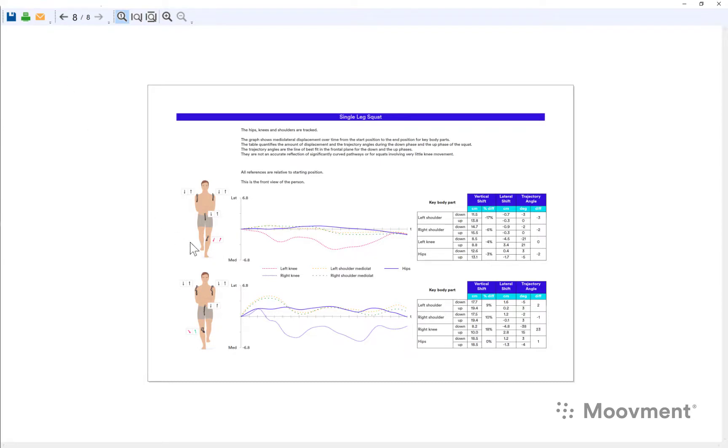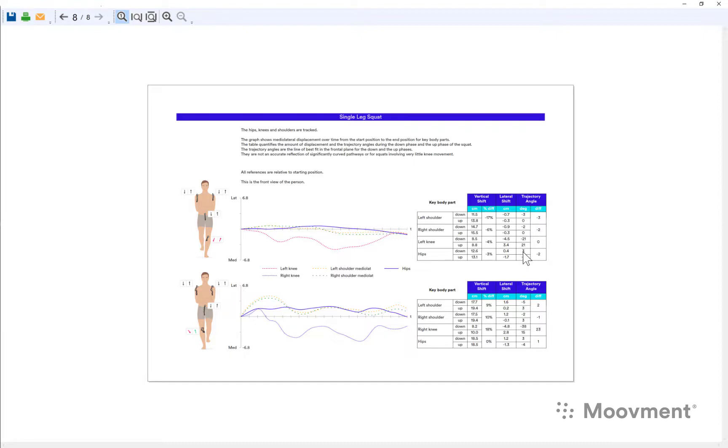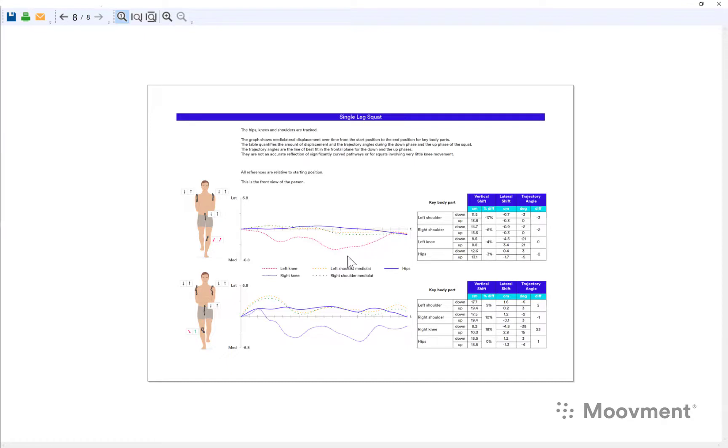In this case the left knee travels in a straight line. It travels at 21 degrees. Its lateral shift is 4.5 centimeters from the top to the bottom with a corresponding movement of the hips going outwards by three degrees or half a centimeter, and not so much movement occurring in the shoulders as you can see here. So these lines are quite flat, but the left knee in isolation is traveling inwards quite significantly.